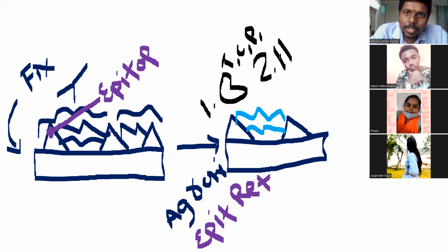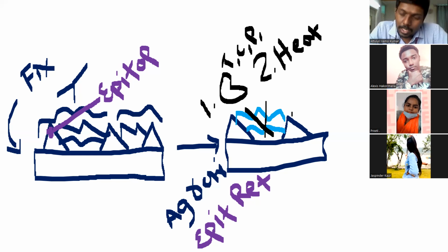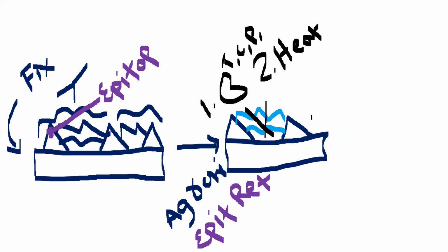The second technique is the heating technique. The idea is very simple. We know that by heating we can coagulate proteins. Now with the help of heating, we are trying to destroy these crosslinks. But when we heat, that not only denatures the crosslink proteins, but it can also damage the antigens, because antigens are also proteins. That is one problem with heat antigen retrieval.